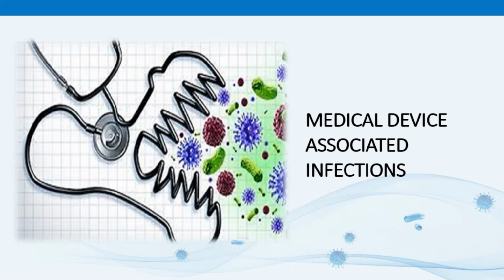Now, according to the most recent data from the CDC, in the United States in 2010, there were over 51 million inpatient surgical procedures and an even larger number of invasive medical procedures like endoscopies. Failure to comply with scientifically based guidelines has led to numerous outbreaks and patient exposures, and you've all probably seen them in the news or heard about them. Due to this non-compliance, back in 2015, the CDC and the FDA issued a health advisory about the need to properly maintain, clean, disinfect, and sterilize reusable medical devices. But we still have outbreaks and infections today.